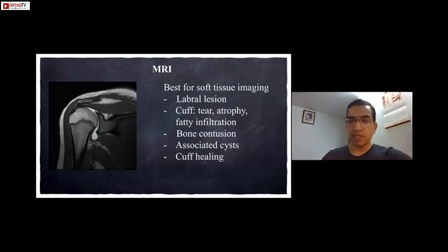This is the favorite investigation, the lady love for everybody. Everybody wants to do an MRI before you talk to the patient, before you clinically examine. Sometimes the patient will also throw their investigation right in front of our face and say, I've got an MRI. Now, Ashish, all of us practice this, and Ashish was very categorical about this: please do not see the MRI or the CT scan or the X-ray unless you have done your basic history taking and examination.